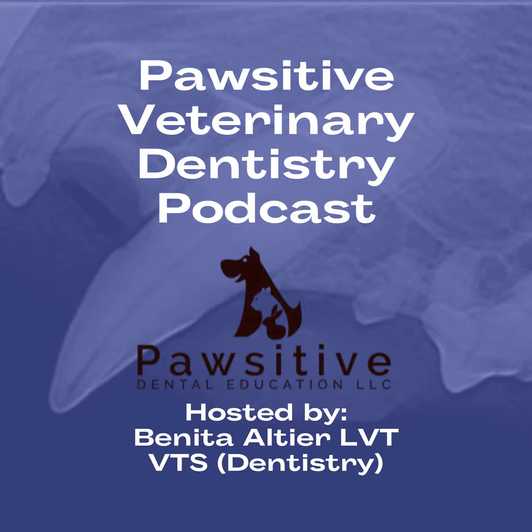From there, then I look at either side of the roots of the tooth to identify whether there is any vertical bone loss. So vertical bone loss is going to be more so bone loss in a triangle or an angular shaped defect, and it is usually associated with a singular surface of a root of a tooth. So even in a multi-rooted tooth, it could be the front or the back, but it's a more triangle shape.